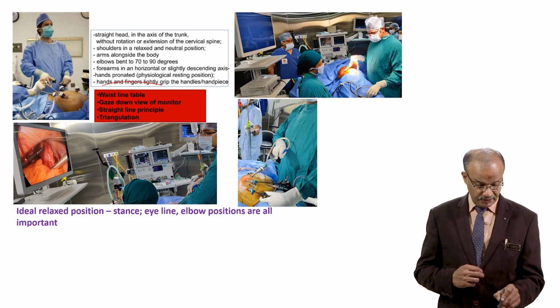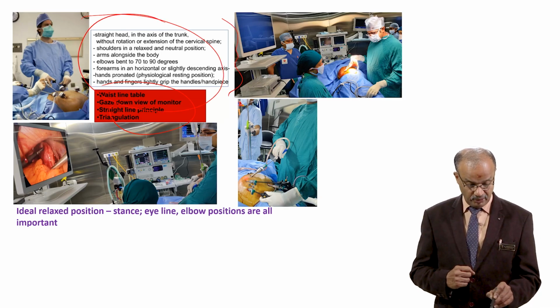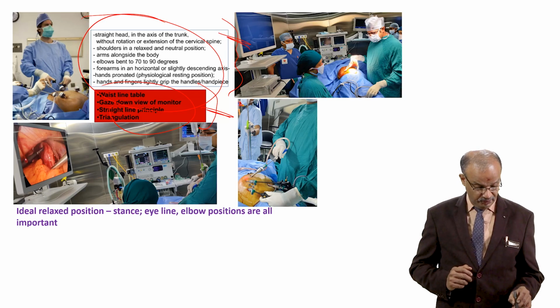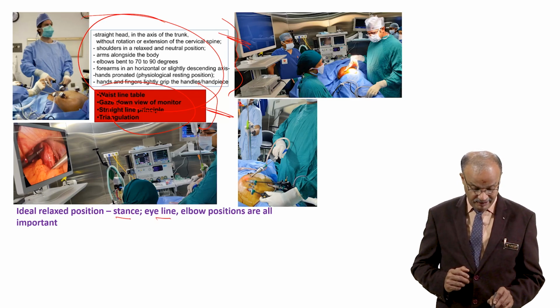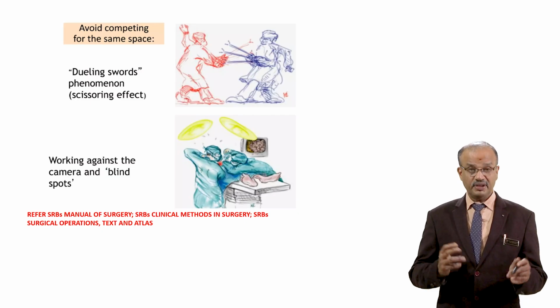So these are the things. I'm not going into detail, everything is here actually. All these principles, you have to always follow. That is very, very important, remember. That is a very basic principle when you do this. So stance, eye line, elbow positions are all important, already told.